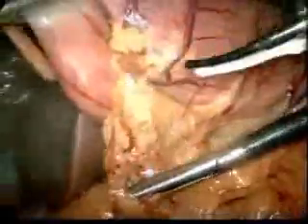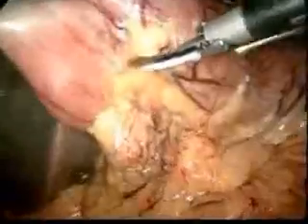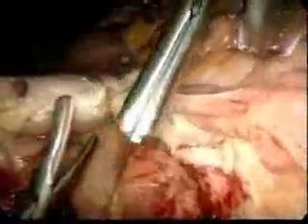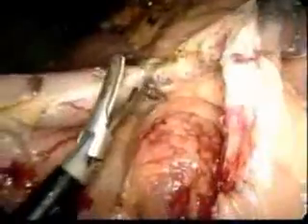The omentum is then dissected off the greater curvature of the stomach. In this case, as in the preceding schematic, the left gastroepiploic artery is taken during the dissection, so the flap is based on the right gastroepiploic artery. Basing the flap on the left artery would allow the flap to reach even more proximally if distance was a concern. Care is taken not to injure the nearby splenic vessels during this dissection.